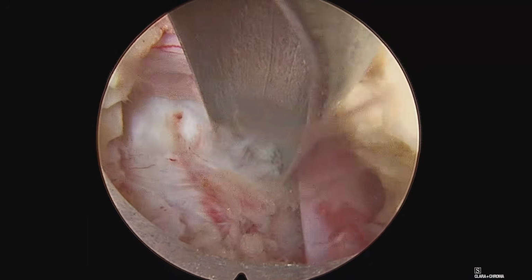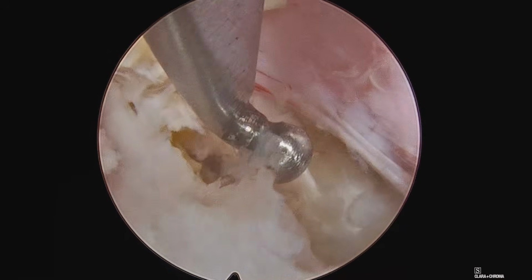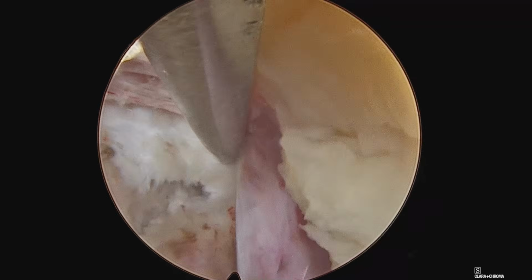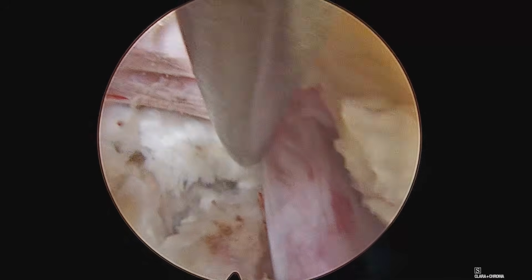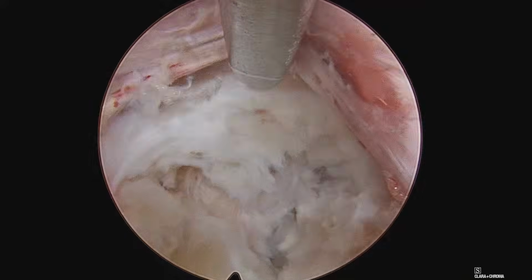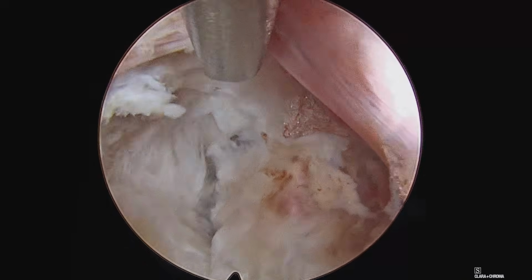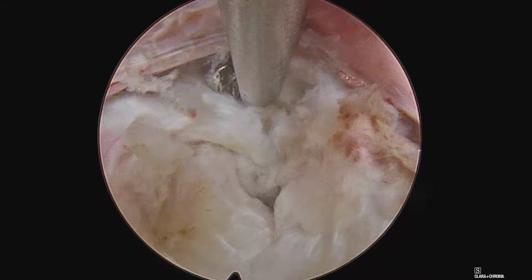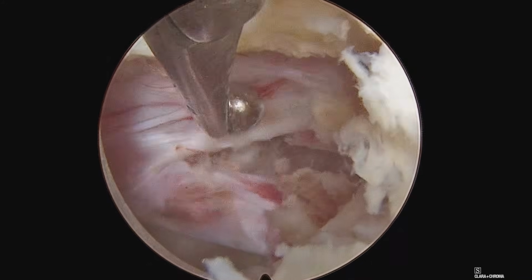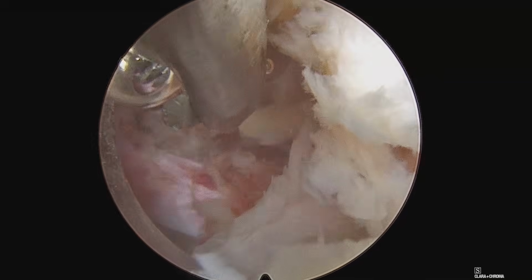So once internal decompression of free fragments is done, we check for any free fragments at the disc level. You can appreciate, because of the 15-degree scope, that we can see under the root and theca, and there were no free fragments at this area.